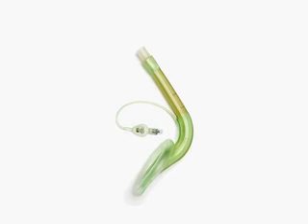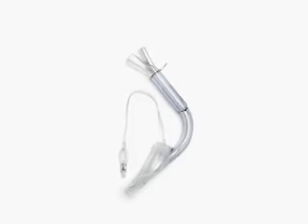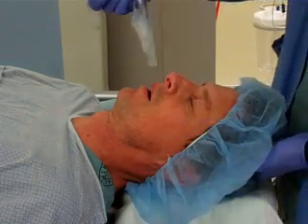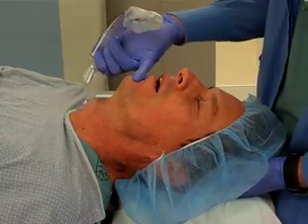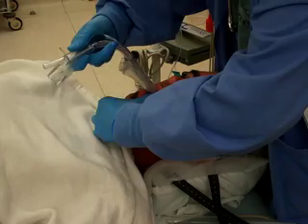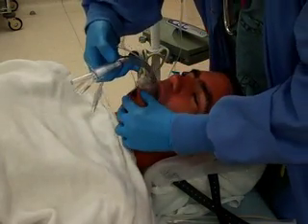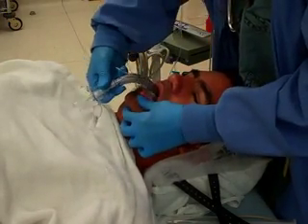Use of a precurved laryngeal mask airway sometimes allows placement without the need to insert hands inside a patient's mouth. To place a precurved laryngeal mask airway, grab the connecting tube with your dominant hand so the cuff points to the patient's head. Your hand should be in a neutral position with the thumb on the upward surface of the tube. As with the straight tube, guide the laryngeal mask airway above and behind the tongue by applying firm pressure along the patient's hard palate.